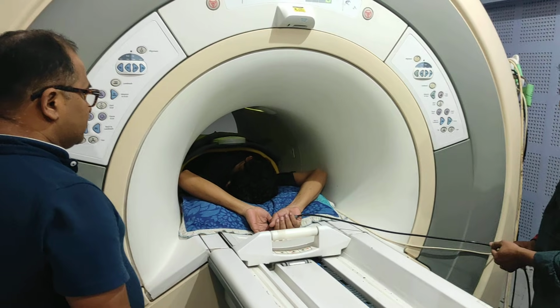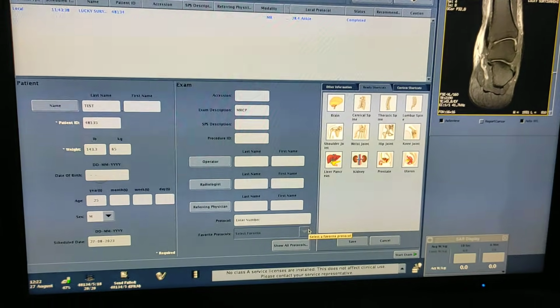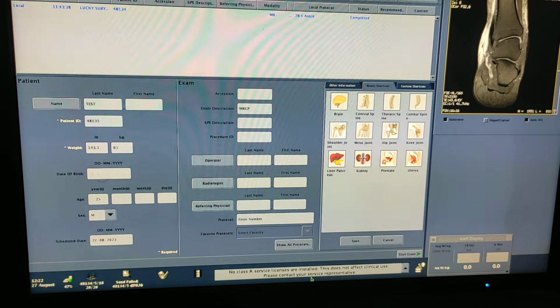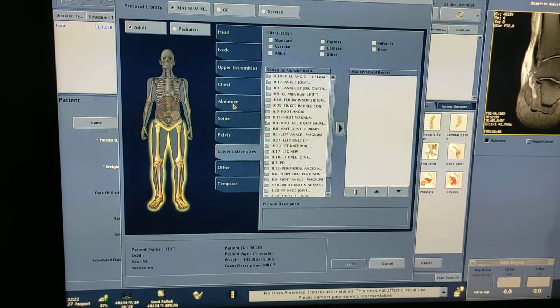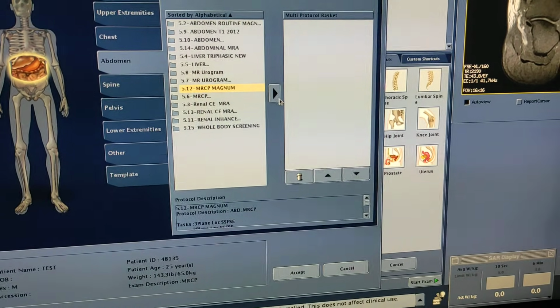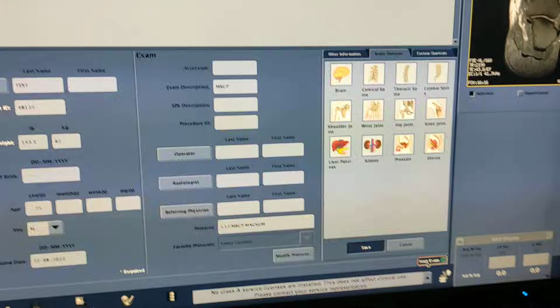Now we will move towards the console. So now we are on the entry desk. First of all, we have to fill in the data of the patient. Description is MRCP. From here, you have to select the protocol. Click on abdomen. Here is my protocol, MRCP Magnum. Enter. Accept. First of all, we have to take the tri-plane localizer.